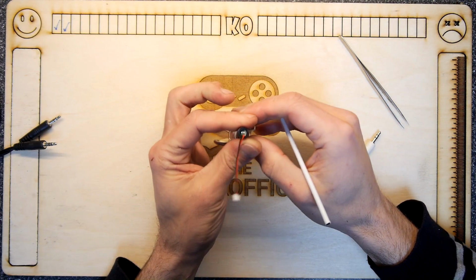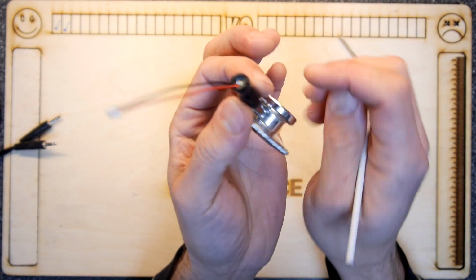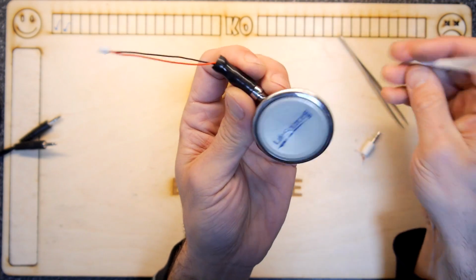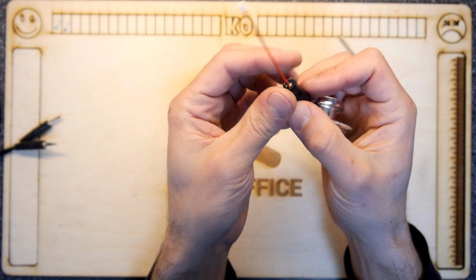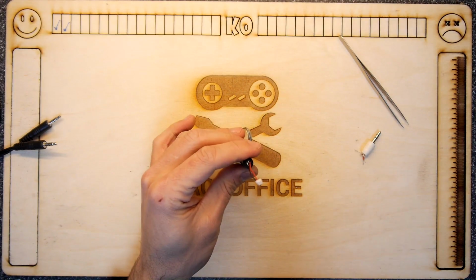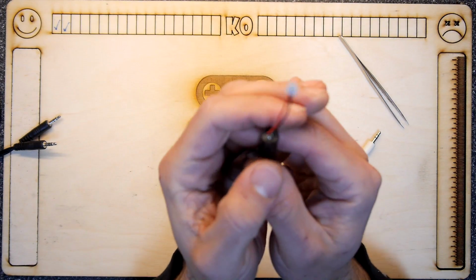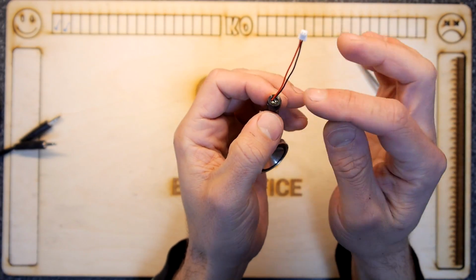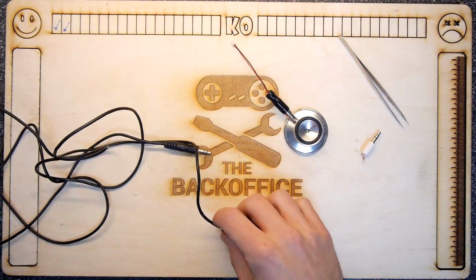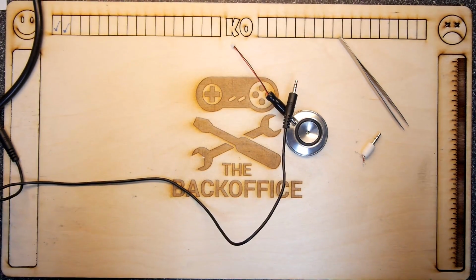Yeah, that works. Just to show you then up close. Little microphone pointing straight down. So any sound that goes through here is going to go straight into that microphone. So groovy. I think that's pretty much done. I'm going to chop the ends here. Well, I've got an option. I can either solder straight to the contacts of the microphone in here again, or I can chop the ends and join. Let's cut the cable first and then see what options present themselves, because I don't know what sort of cores and things are going on in there.